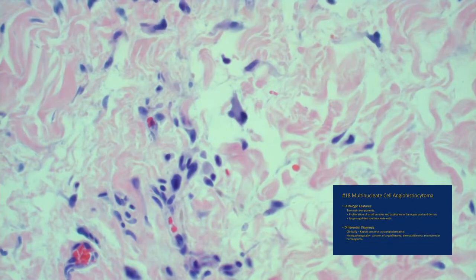So, again, these pleomorphic lesions can look sort of like this, but just make sure that you don't overcall this as a cancer, because these are not that. So it's just probably some sort of reactive process. I'm not sure anybody really knows what causes this thing. But it's a very interesting little entity. So I recommend going back and reading a little bit more about this thing. Okay, 19.